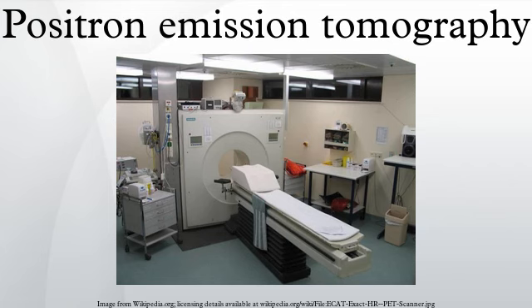Use of this tracer to explore the possibility of cancer metastasis is the most common type of PET scan in standard medical care. However, on a minority basis, many other radioactive tracers are used in PET to image the tissue concentration of many other types of molecules of interest.